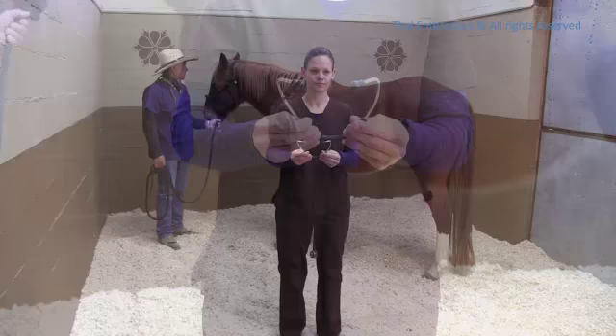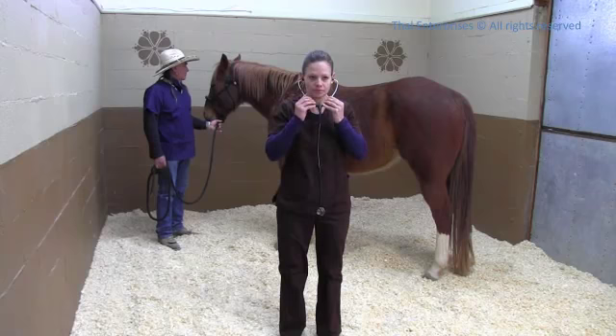To listen to your horse's heart rate with a stethoscope, make sure your ear pieces are pointing forward before you insert them into your ears.